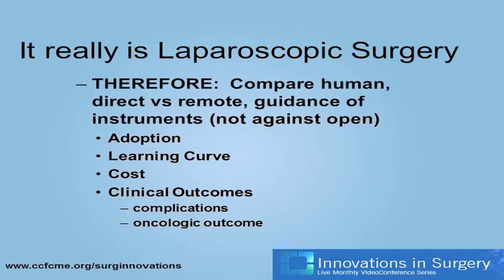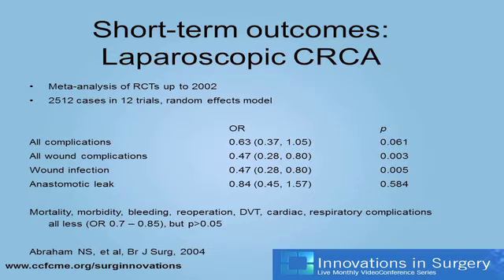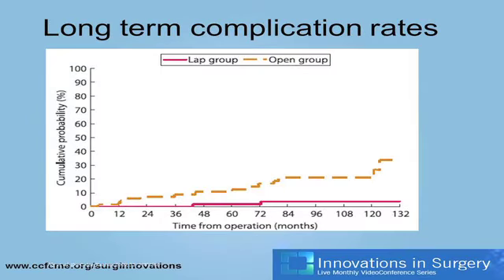So you've seen some data about laparoscopy, and just to remind everyone, laparoscopy is clearly better than open. Lower complications, lower cardiovascular risk, on and on, lower wound complications. So clearly the platform for the future is about minimally invasive approaches, not about what is driving the instruments. Long-term complications are also better, primarily related to the wound. There is a much lower rate of hernia in laparoscopic procedures because of smaller and alternative extraction sites, and probably a reproducibly lower risk of small bowel obstruction.